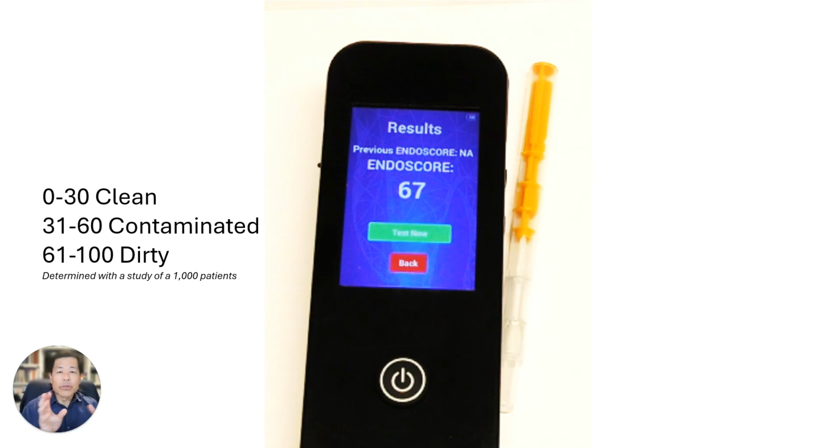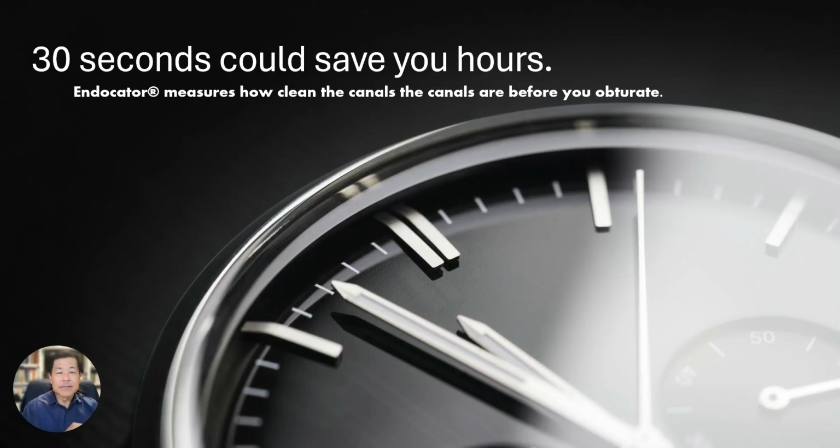So if we have a score over 31, we want to go back in there, maybe with some more instrumentation, definitely some more irrigation, and then do another test until we get that count below 30. So again, now we have something that can quantify the amount of bacteria in that canal system. So when we do obturate and seal that up, we know we're going to have endodontic success.